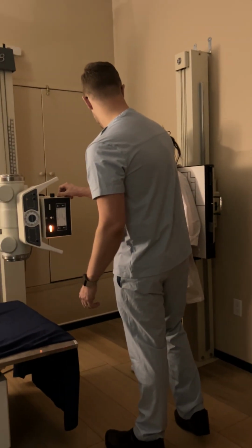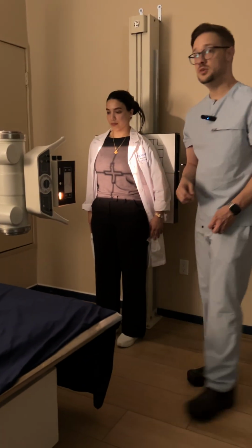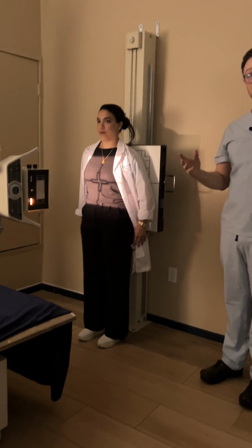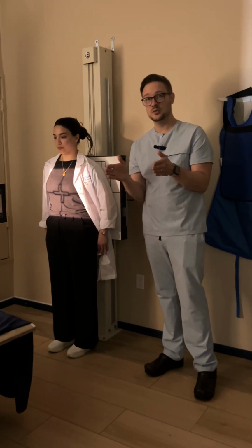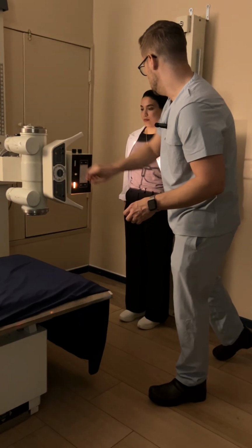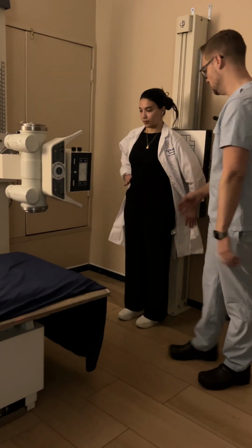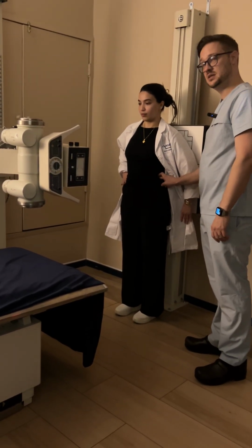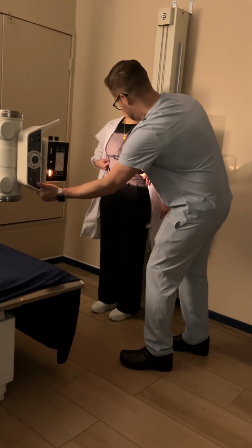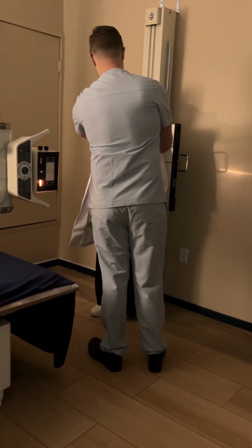What I'm going to do is make sure I'm open to the full height of my cassette. Usually I don't ever collimate in this dimension unless I'm way into their chest or they're a child. I would maybe collimate a little from side to side depending on the body habitus, okay? But usually on an adult, you're not going to need to do much collimation for an abdomen. The reason this works so well is because now my x-ray tube is so much closer, I can use my right hand to find her crest and go 2 inches up with my index finger. Now I know my centering point, and I just adjust with my left hand, okay? Then I make sure she's nice and centered. I'll make sure that was your crest, right?